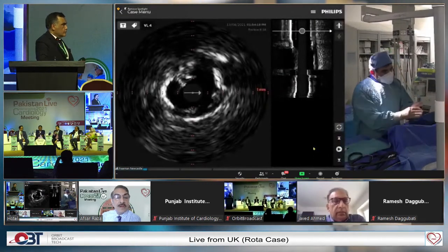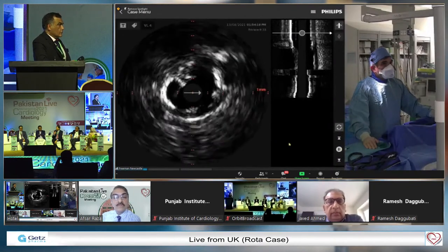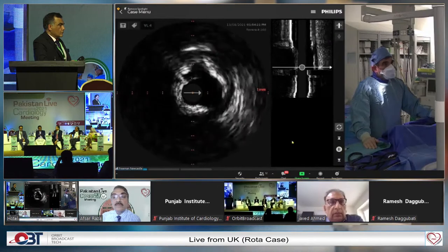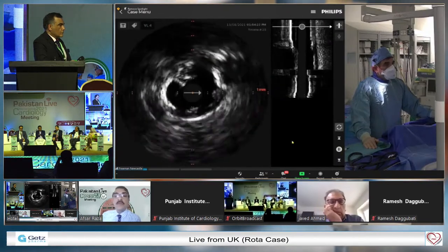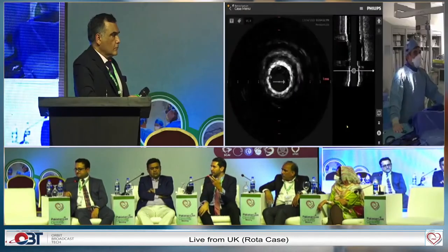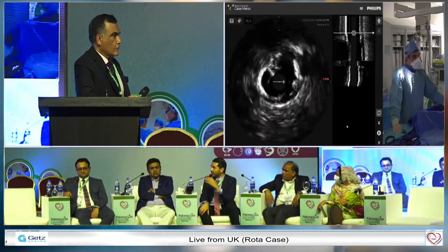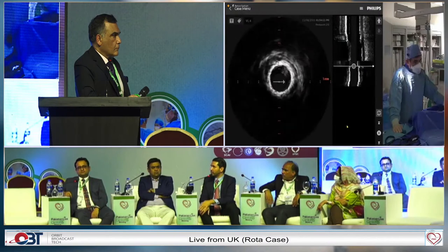When the IVUS catheter didn't go in the beginning, sometimes some people use that as a test. If you can get the IVUS catheter down, then you should consider taking the IVL catheter, the intravascular lithotripsy catheter, down as well. I guess after the 1.25 burr with the aneurysm there, instead of going into the bigger burr, could you consider a rotatripsy in this case? You've done the 1.25 burr, you've made room, bring the lithotripsy balloon now and use that as a consideration?